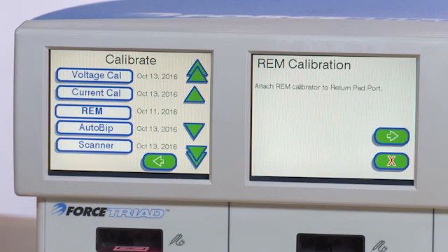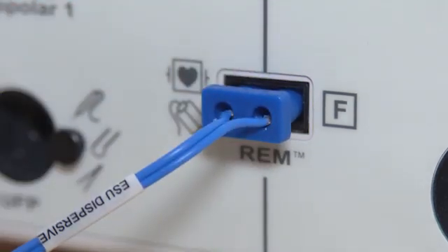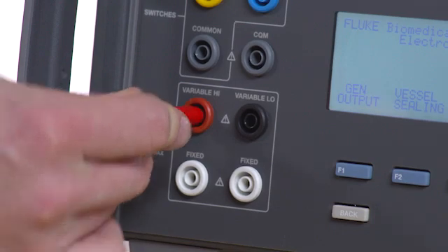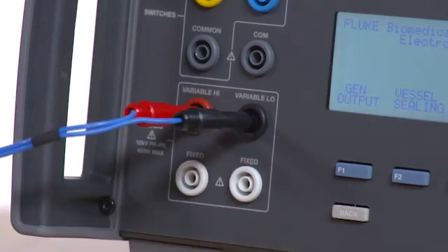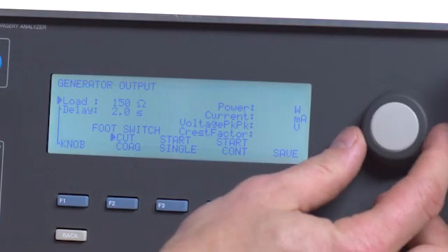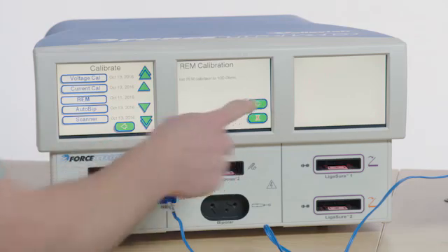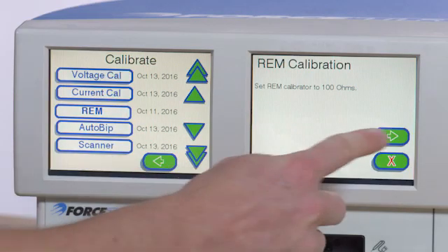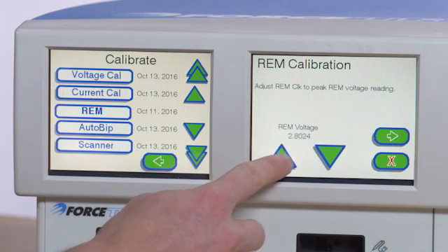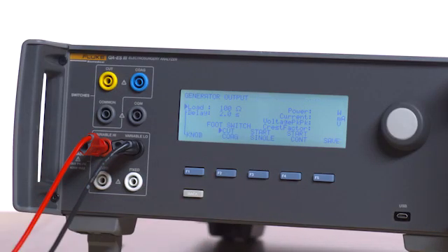Step 10: REM Calibration. Select REM from the Calibrate menu on the Force Triad. Connect the ESU CQM safety lead to the REM port. Connect the red banana test lead from the ESU CQM safety lead to the variable high on the QAES-3 and the black banana test lead to the variable low on the QAES-3. Press back and then F1 for generator output. Select 100 ohm load. Press F4 for start continuous. Select Next on the Force Triad. Press Next one more time. Use the up or down arrow keys on the Force Triad to adjust the peak REM voltage as measured on the QAES-3. Select Next when completed. Press F3 on the QAES-3 to stop the test.